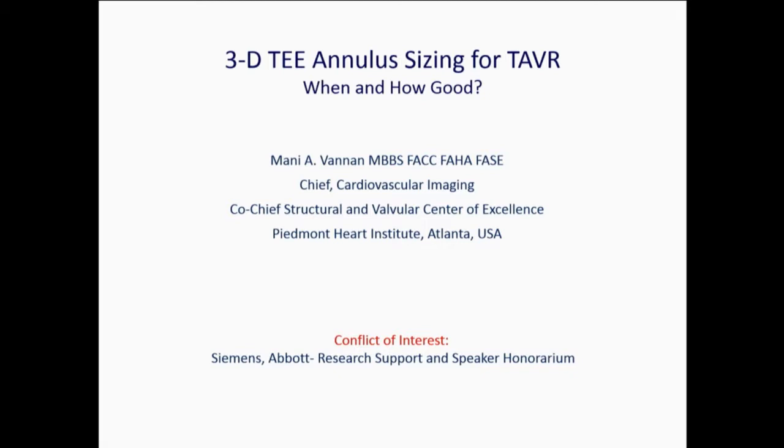As you know, a lot of the literature about comparing CT versus echo, whether it be 2D or 3D TEE, was all in the time when a lot of intra-procedural TEE was done. And as we know, that has changed quite a bit, and it continues to change, so that we almost do no imaging. For example, at Piedmont, we probably take 2 transthoracic pictures, a couple at the end, to make sure there is no obvious PVL, severe PVL, or pericardial effusion. I don't even go into the cath labs anymore, so it's a completely fluoroscopic procedure.